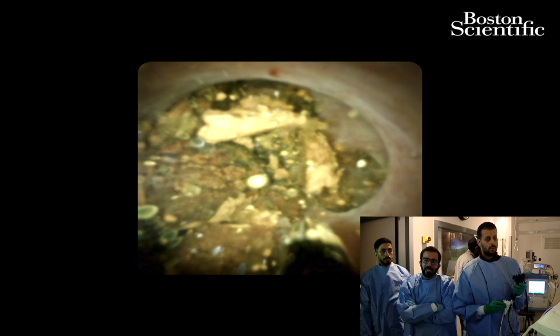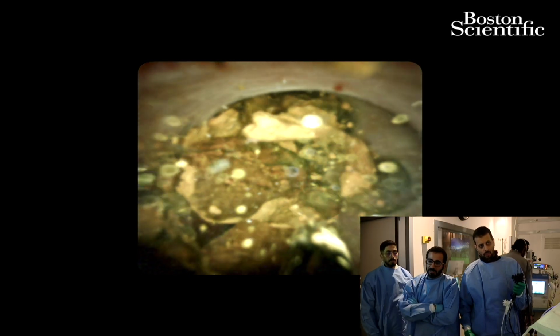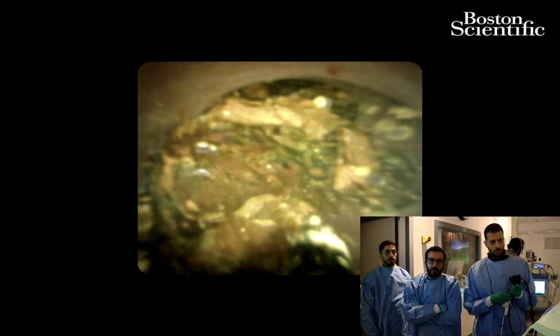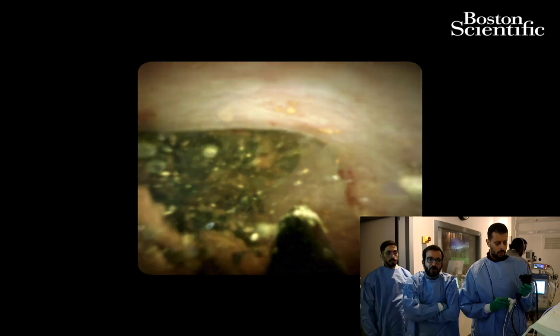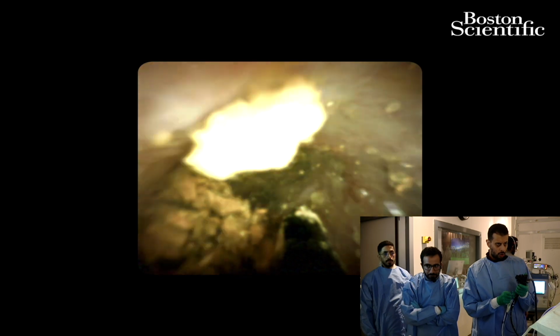So we're probably just going to dilate to 10 just to allow these fragments to come out, and then we'll clear the CBD from the stones, and then we place a plastic stent, probably 10 French, 10 centimeter, and we'll give the patient antibiotic, as cholangioscopy requires antibiotic also after, like Cipro if she's not allergic, for 3 to 5 days.